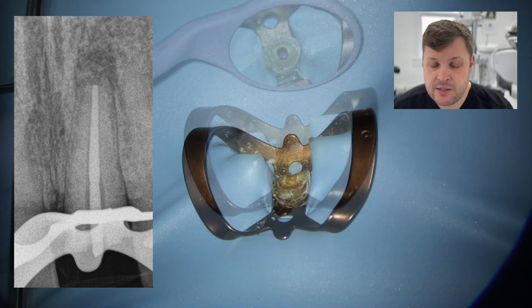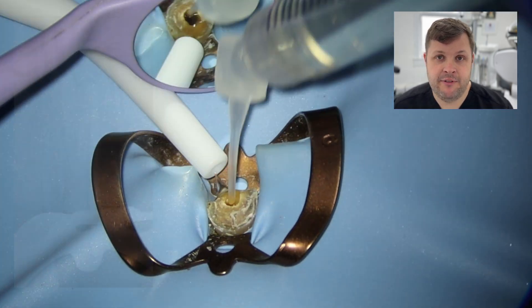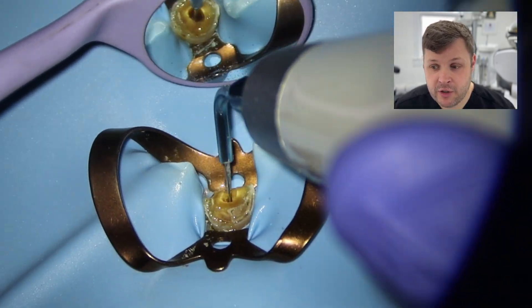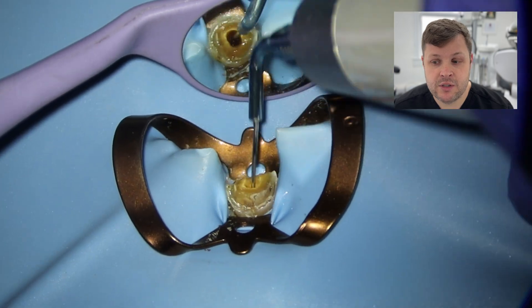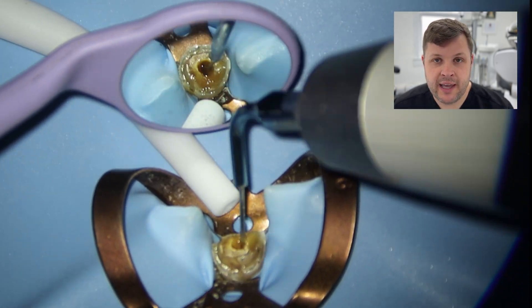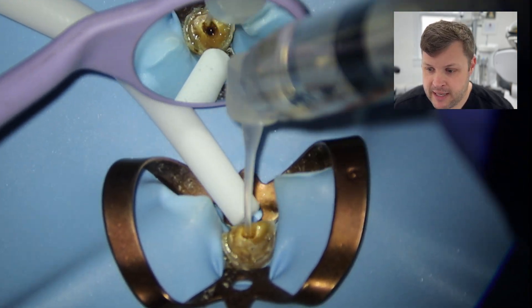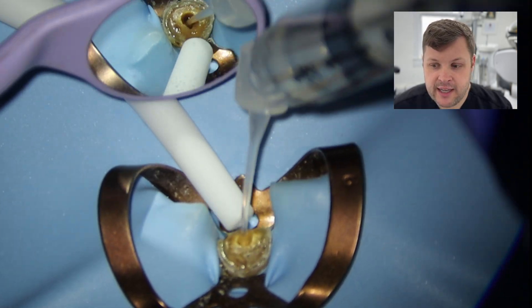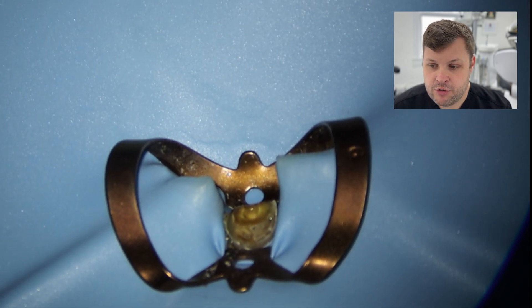I'll take the GP point out now and do the final disinfection protocol. You've got to be super careful — the apex is super wide — so you don't want to push irrigant out of the end. Keep the tip two millimeters away from the apical end. The canal space is now nice and clean and I'm going to dry it with paper points.